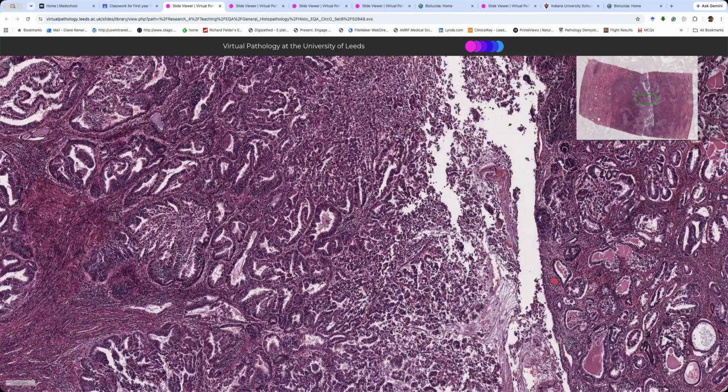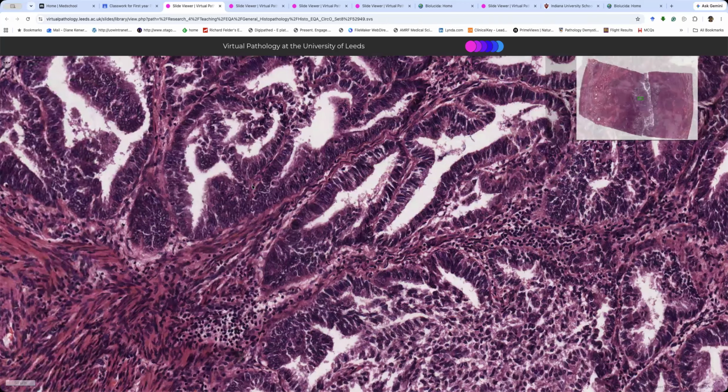Endometrioid. How do we know it's endometrioid? By the shape of the glands and the stacking of the cells. Right. In low grade, it's easy because they have these cigar-shaped nuclei and they are pseudostratified. Okay. In higher grade, it's hard because they round up and start looking much more atypical, and you might confuse it with the serous.